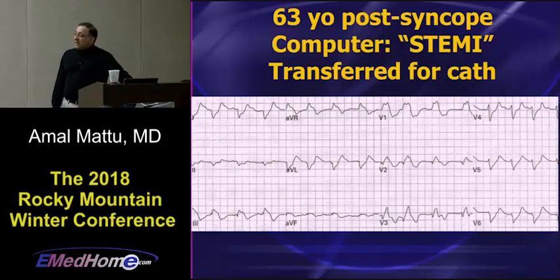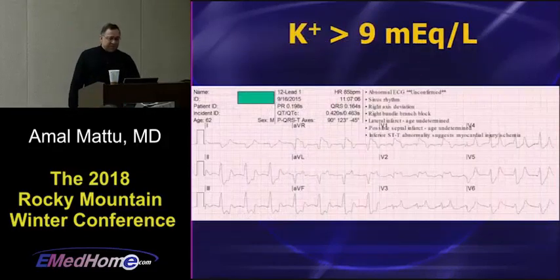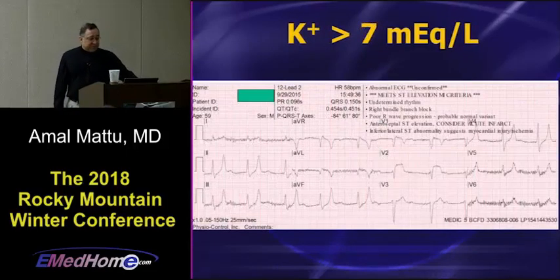So before giving any heparin, the patient, I think, had already gotten Plavix, which doesn't treat hyperkalemia. They gave calcium and they gave bicarb, bam. Problem solved, the patient got admitted to medicine instead. Nothing more than hyperkalemia. Here's a couple of other nice cases. Again, the computer's calling this an acute anterior wall STEMI, with ST elevation in V1, V2, aVR, and a rightward axis. That's hyperkalemia.